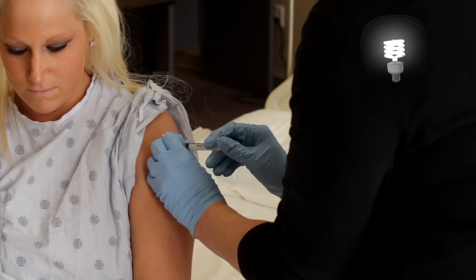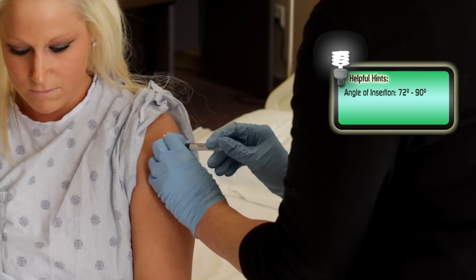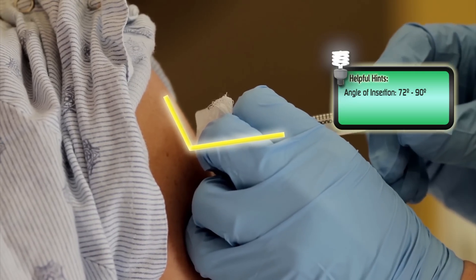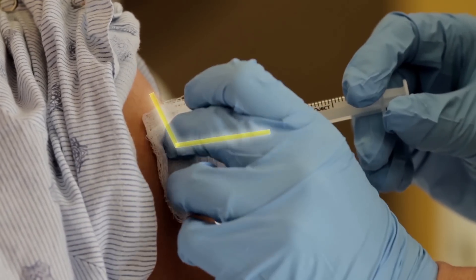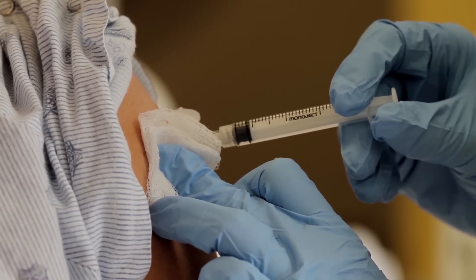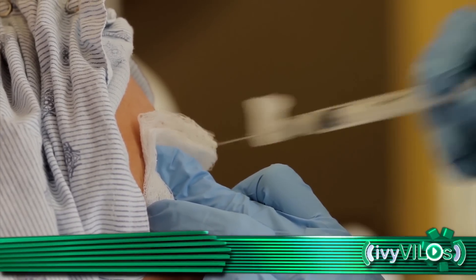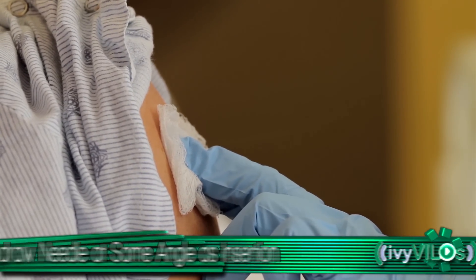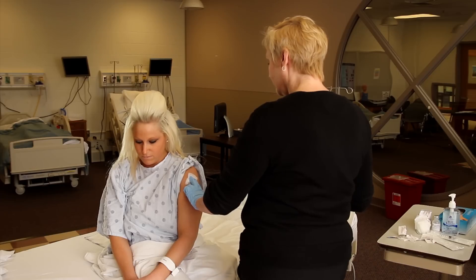The angle of intramuscular insertion should be between 72 and 90 degrees. Withdraw the needle smoothly at the same angle of insertion. Apply dry gauze with gentle pressure. Do not massage the site.